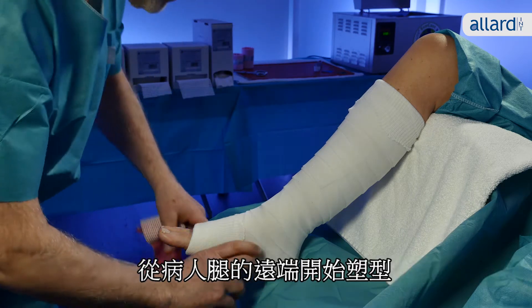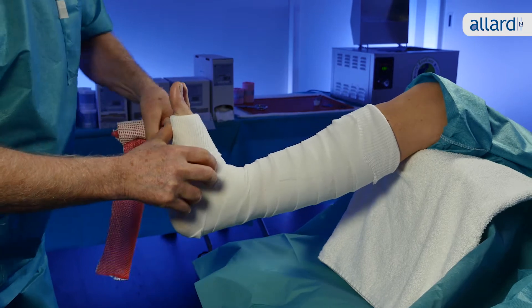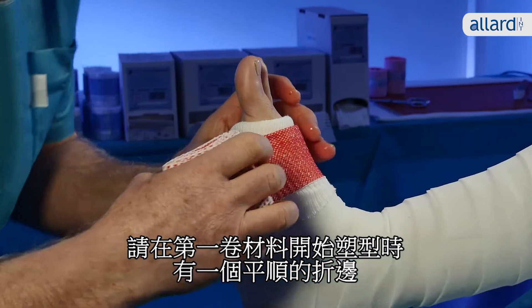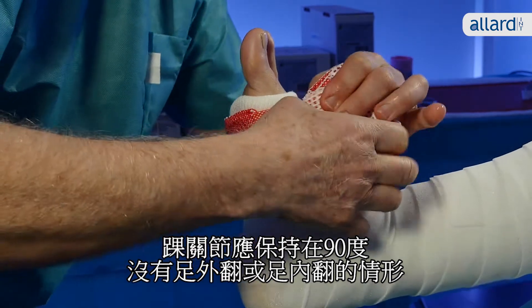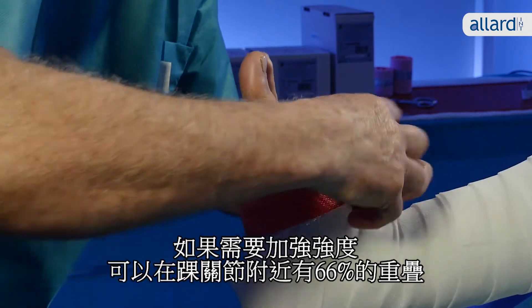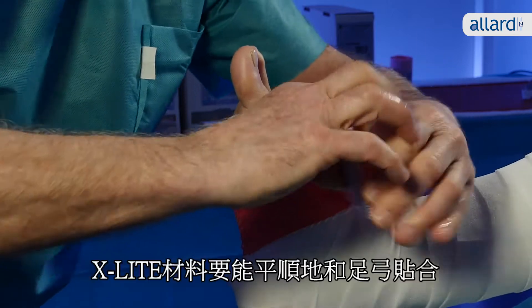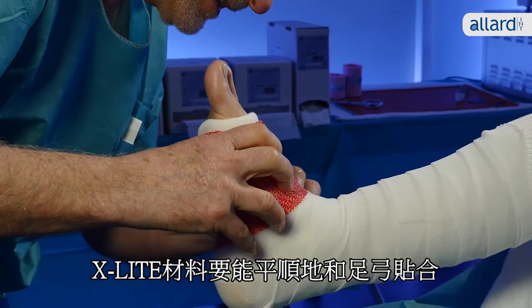Start casting your patient at the distal end of the leg. Fold the first 10cm of the roll for a nice smooth edge at the beginning of the cast. The ankle joint should be at 90 degrees with no eversion or inversion of the foot. For extra strength, overlap with 66% around the foot and ankle. Smoothen the X-Lite material so you get a nice fit into the arch of the foot.